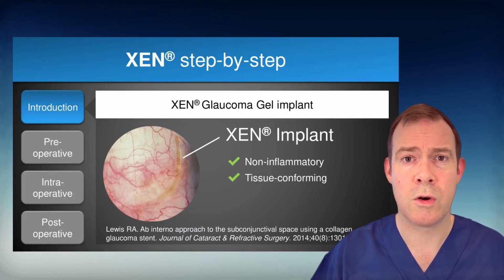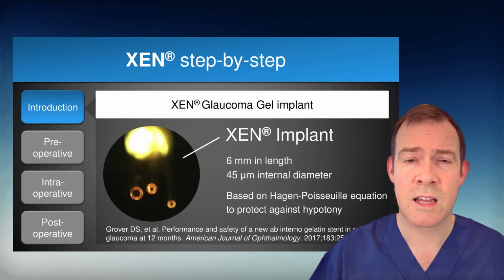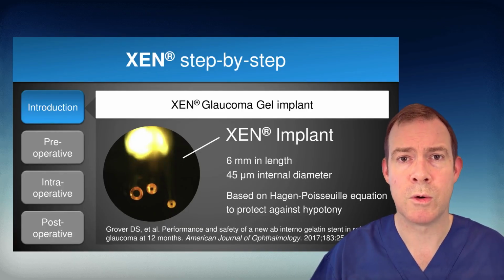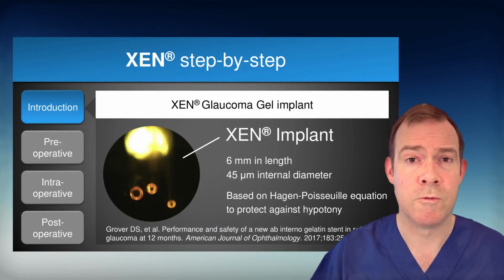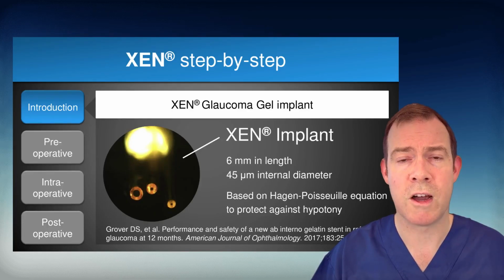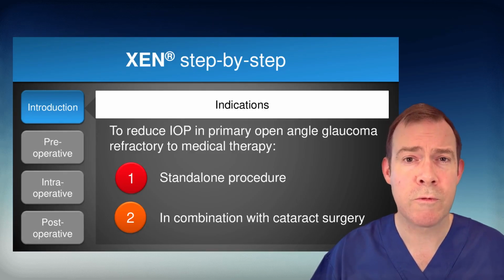The material is non-inflammatory and tissue conforming. The XEN's dimensions have been carefully selected to provide resistance to aqueous outflow to prevent against hypotony, which can lead to potentially serious and sight-threatening complications. There are various versions of the XEN, and the XEN 45 is 6 millimeters in length with an internal diameter of 45 microns. It's indicated to reduce IOP in primary open-angle glaucoma, which is refractory to medical and/or surgical therapy.